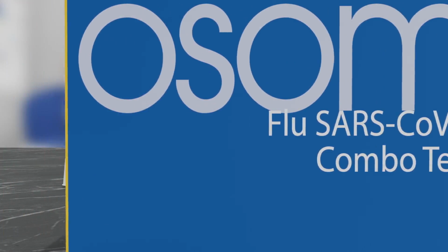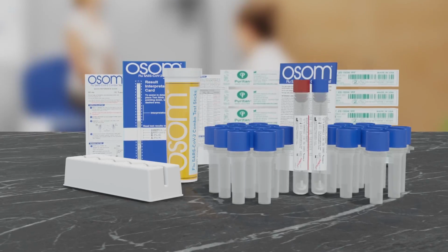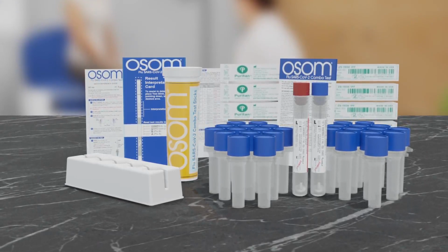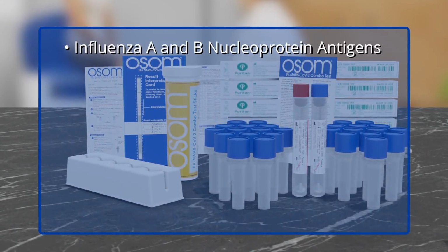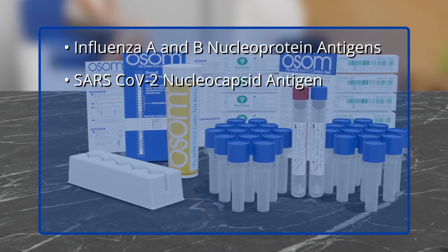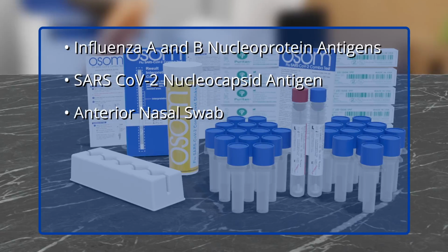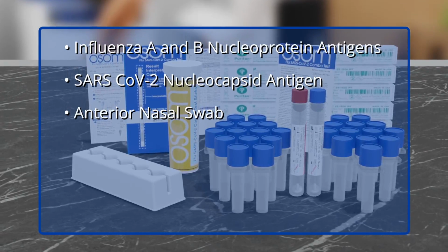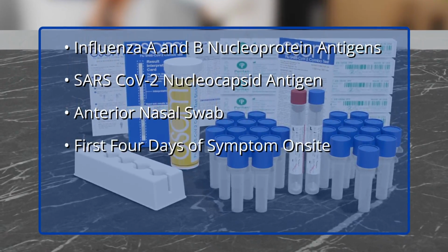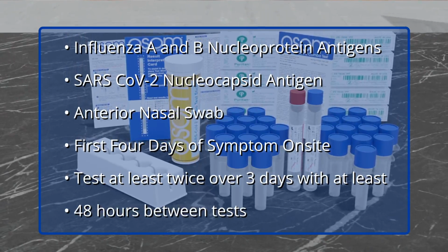The OSOM flu SARS-CoV-2 combo test is a lateral flow immunochromatographic assay intended for in vitro rapid simultaneous qualitative detection and differentiation of influenza A and influenza B nucleoprotein antigens and SARS-CoV-2 nucleocapsid antigen directly from anterior nasal swab specimens of individuals with signs and symptoms of respiratory infection consistent with COVID-19 by their healthcare provider within the first 4 days of symptom onset when tested at least twice over 3 days with at least 48 hours between tests.